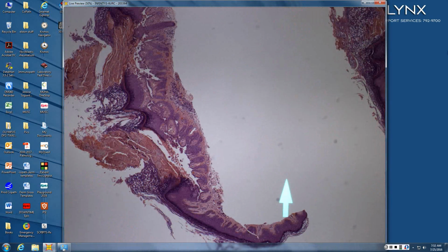So we have an epidermal structure. It looks like there are villi in there again. Okay. Looks like villi, and what are the little round bodies? Okay, so if you were a Frenchman and you were trying to describe round bodies, you would call them corps ronds, right? And in fact, when they were described originally by Darier, he thought they were an infectious organism.